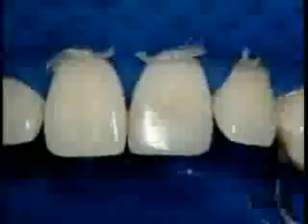The rubber dam is placed with ligatures around each tooth to ensure perfect isolation. We start by cleaning the dental surfaces with a small brush mounted on a contra-angled handpiece and a polishing paste, which is later removed thoroughly by means of prolonged rinsing.